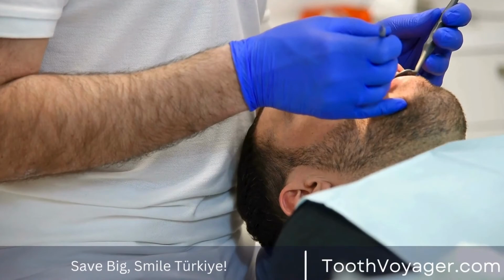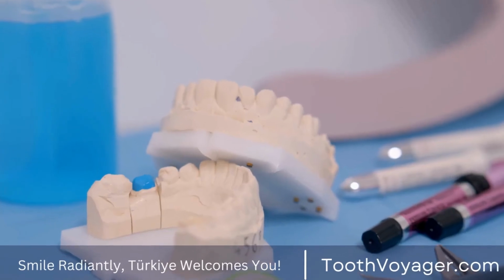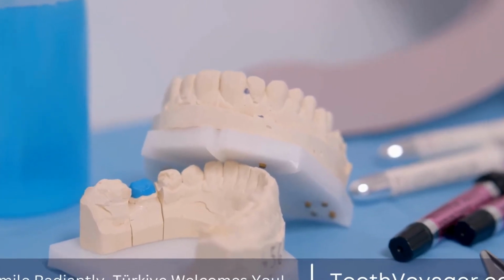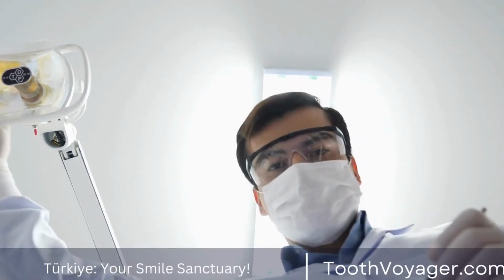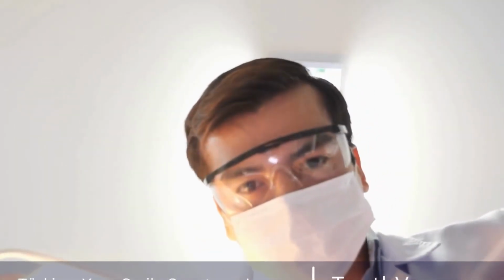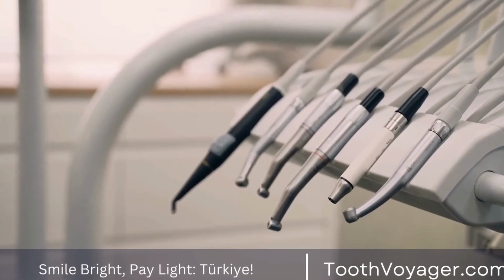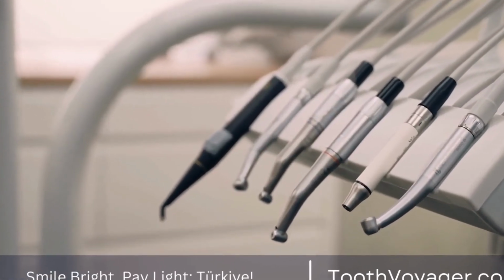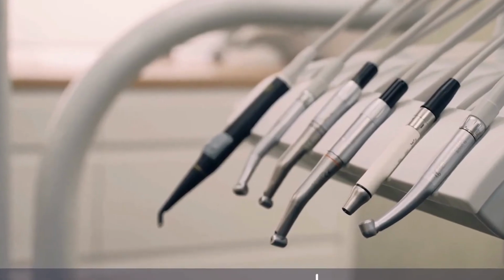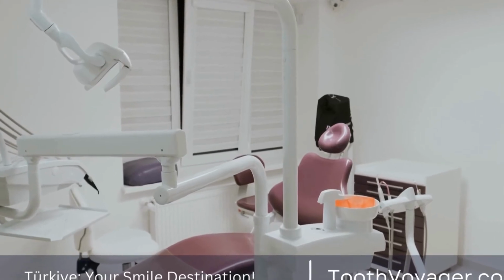When the teeth are taken care of, the next stage is root planing. Root planing involves smoothing the root of teeth in order to keep bacteria from sticking. The procedure is carried out using specially designed tools that fit between the gums and the teeth to get rid of any bumps or blemishes. This procedure can be more time-consuming than scaling because it involves a more thorough process to ensure that the roots are clear and smooth.